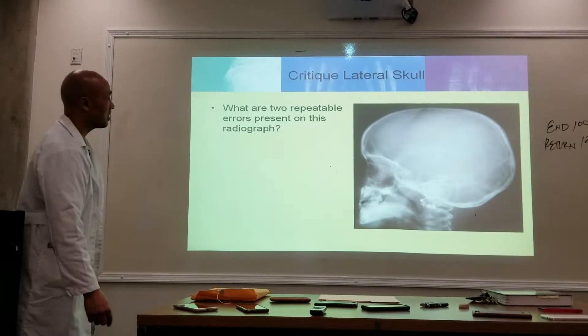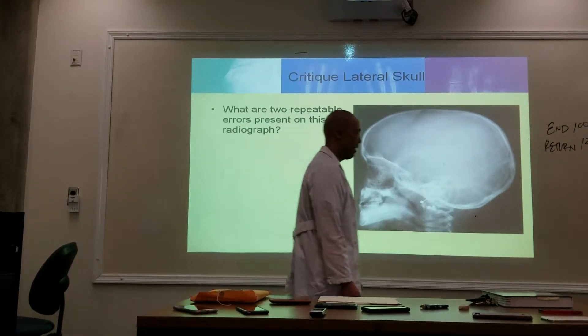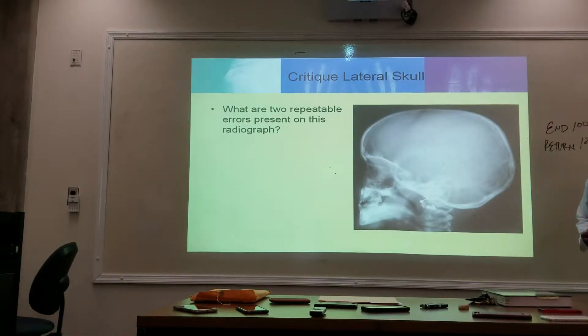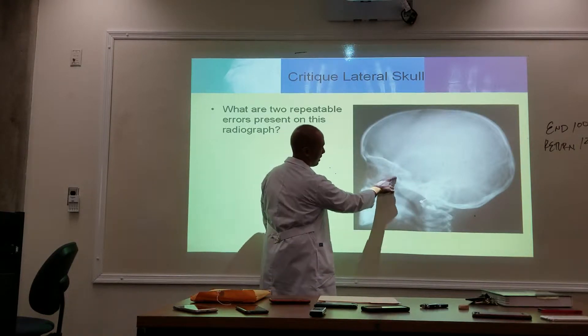Here we have a lateral skull. What are two repeatable errors present here? The rotation. E, A, M — right? Position-wise it looks good, because there's one line here, one line, slightly off over here. But what is this?